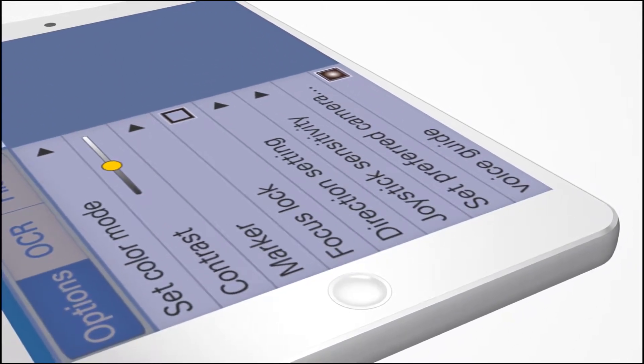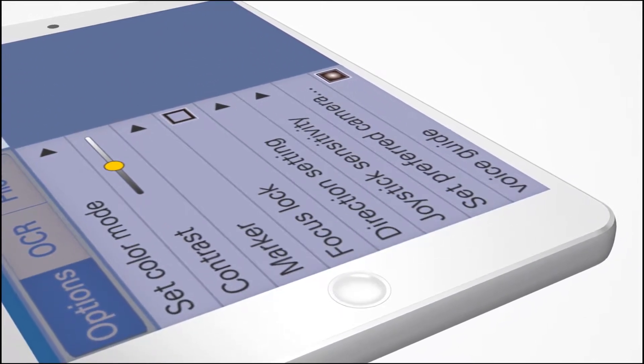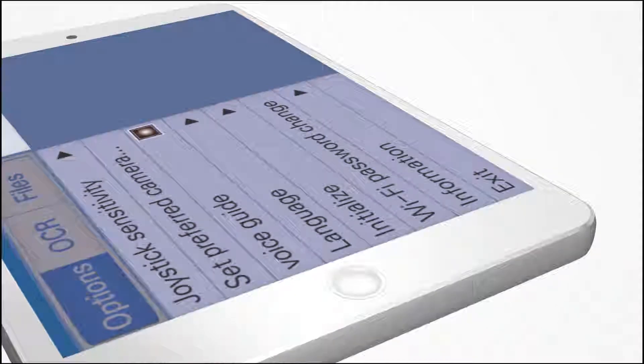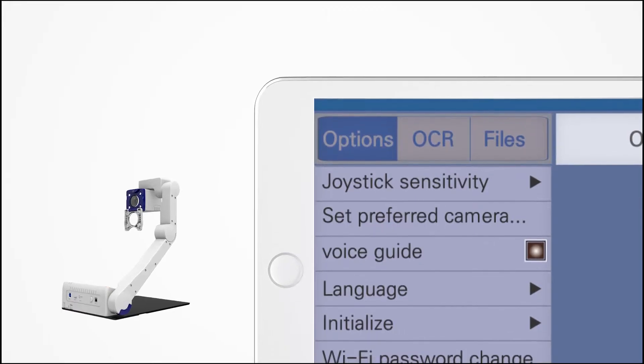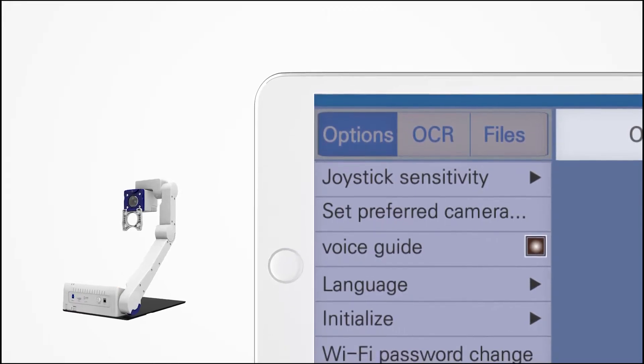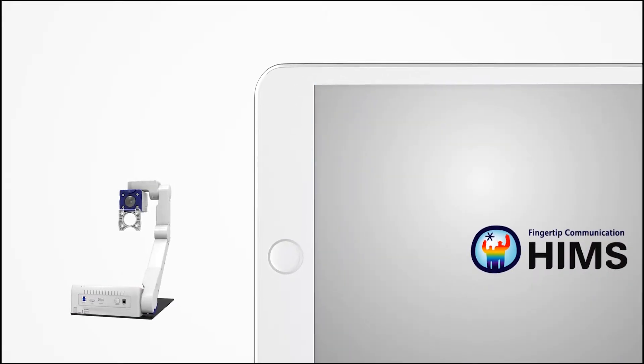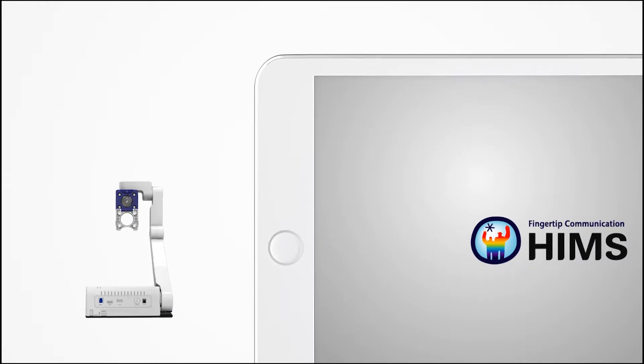When connected to an iPad or Android tablet, manipulate the view and control the eBot's functions directly from your tablet.